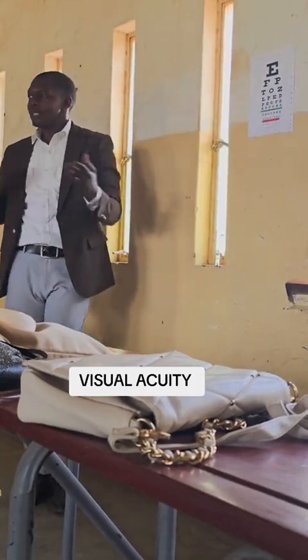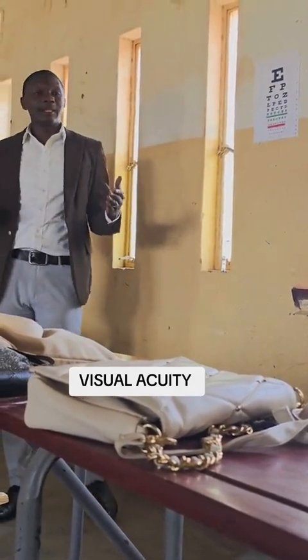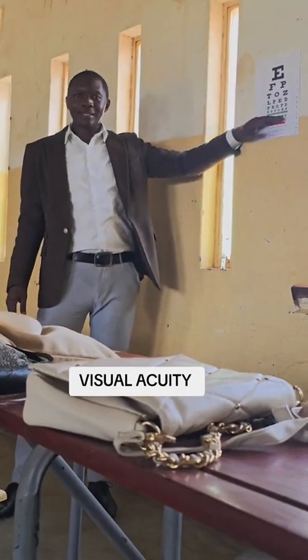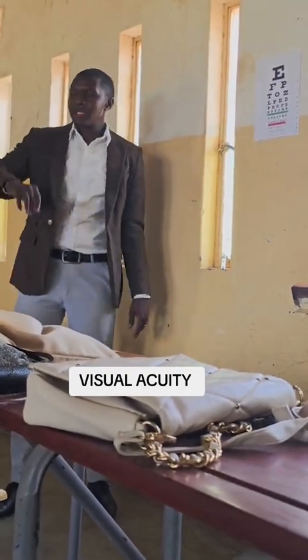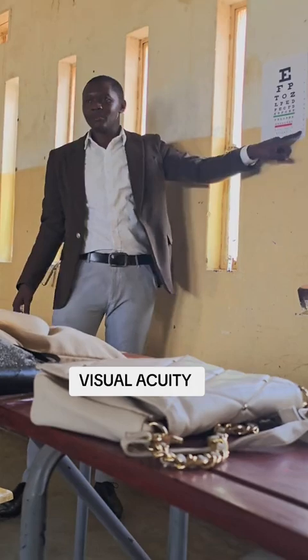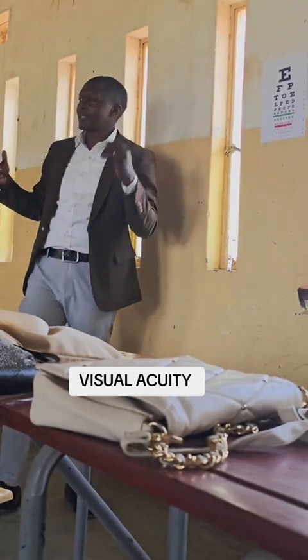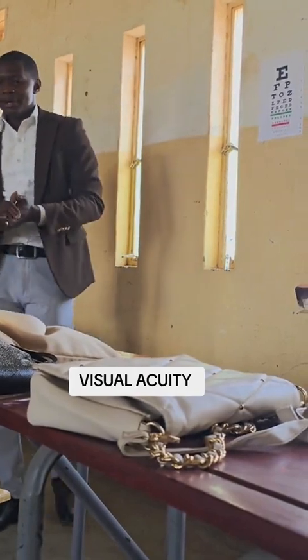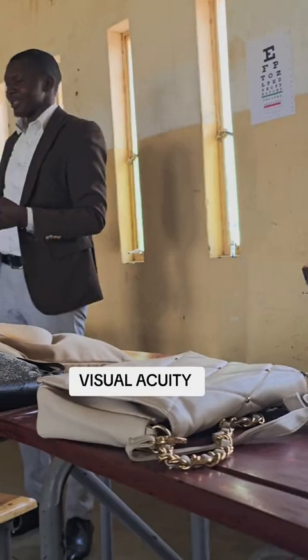If they repeat the way it came in the last exam, the patient was forced to see all the 6 lines. So it was a standardized patient, but it should be someone who's able to read all the letters up to 6, meaning the recording was just 6/6 on both eyes. So that is on recording. So we can do the procedure.